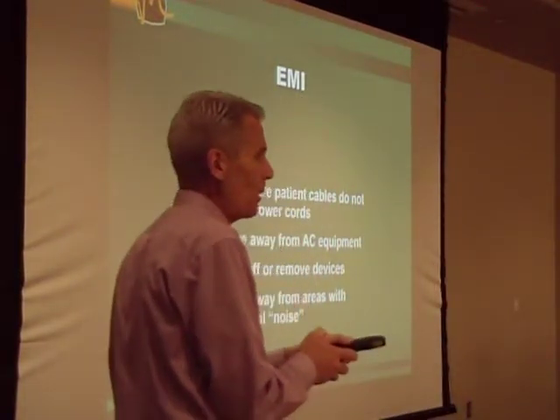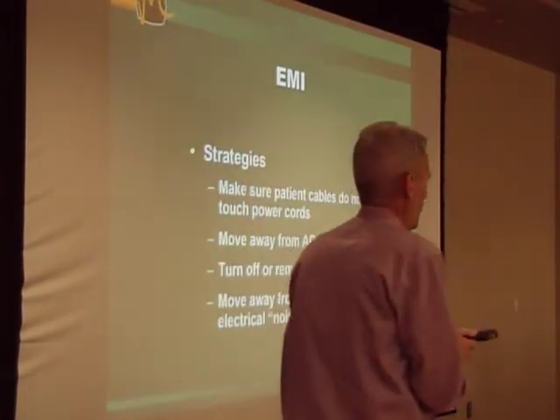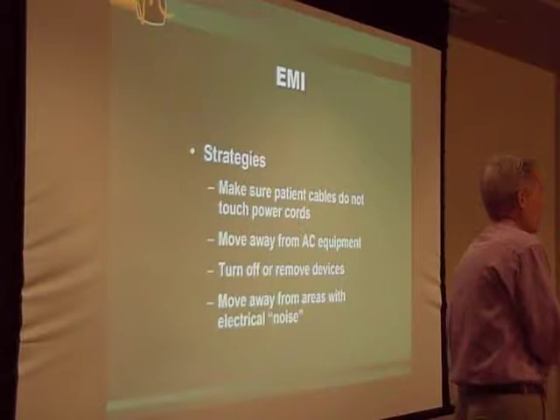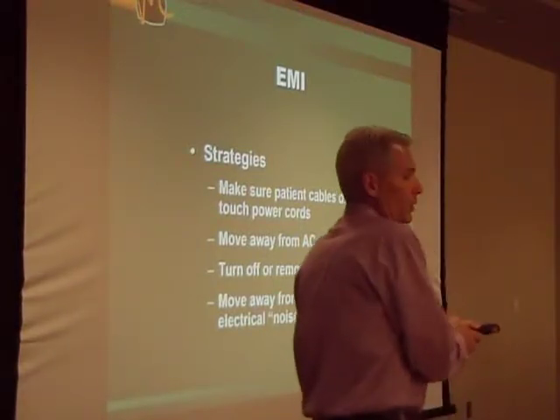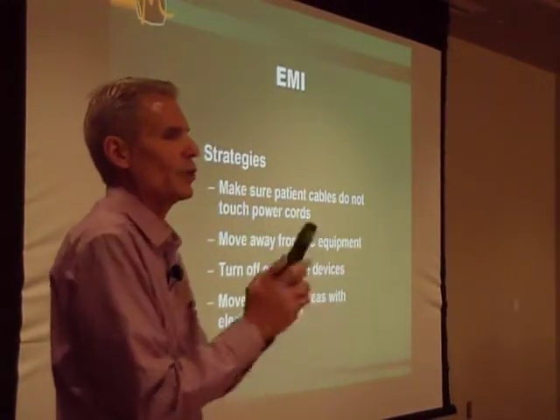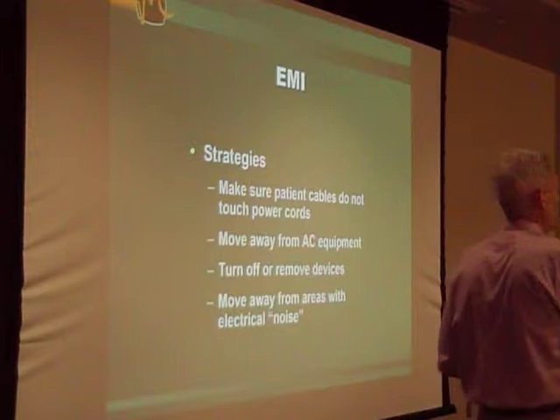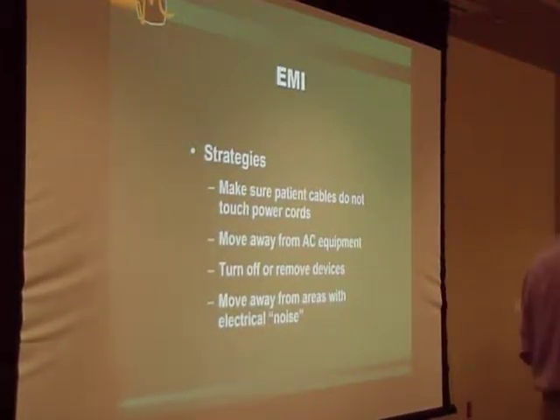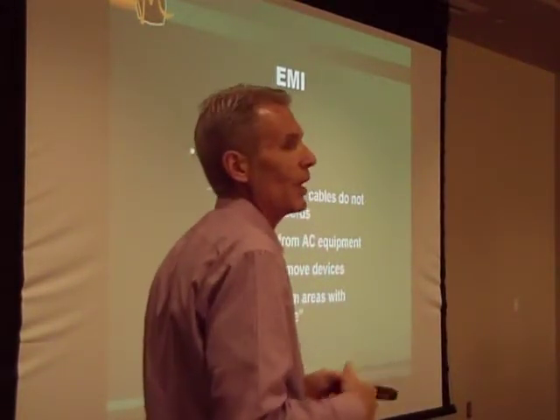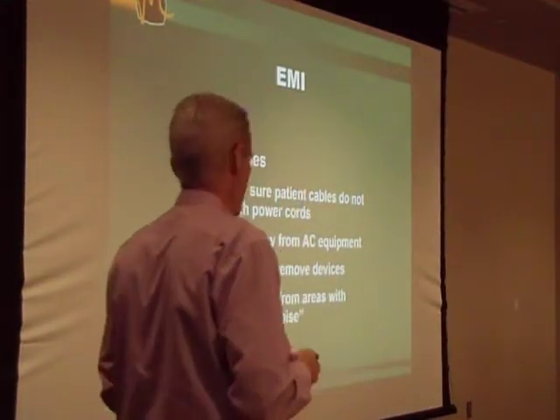We were externally pacing the patient, and we had the patient very well sedated, and we're on the way, and all of a sudden the pacer shuts off. We're all looking at each other trying to figure out why this thing isn't working, so we're trying to troubleshoot it. There wasn't anything wrong with the device. It was attached to the patient and everything. It started working again, everything's fine, and then a few minutes later it shuts back off again. What we found out was the person that was driving us was using a cell phone, and every time they would engage with that, it would shut the pacer down on the LifePak. I'm not saying that's a common occurrence. I'm just saying there are things that can cause interference. Just look around and maybe you can isolate what it is.